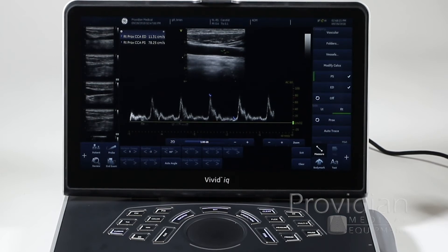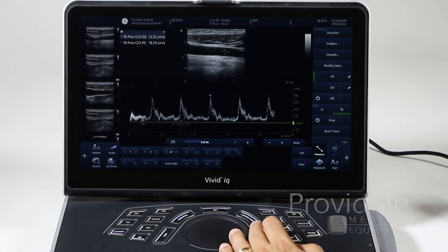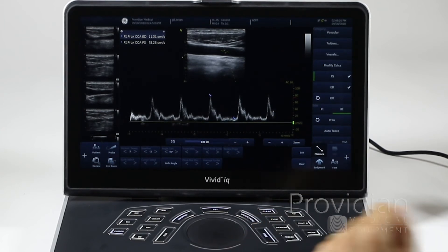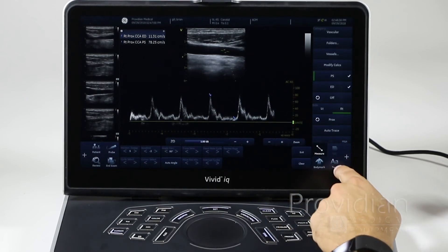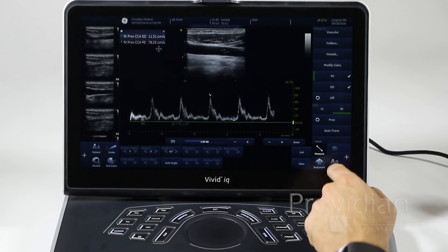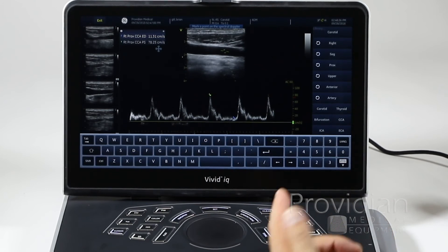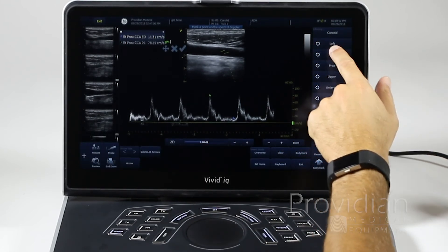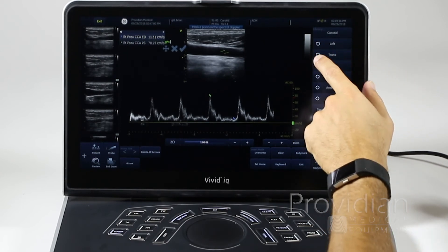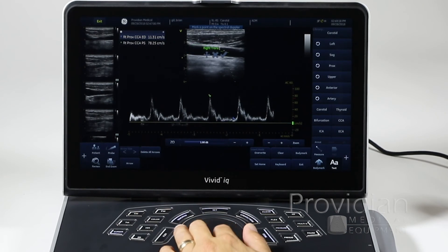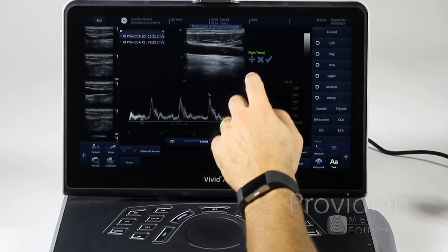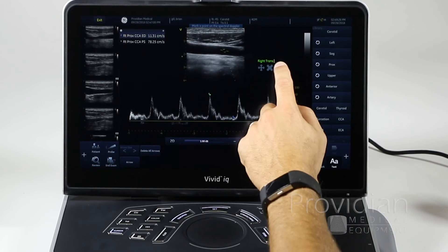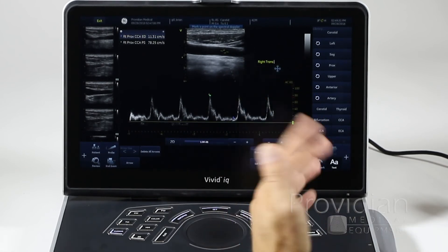For annotations, there's quite a library because tapping on a touch screen keyboard isn't a whole lot of fun. So if we want to annotate this, you just hit these A's here and can start typing in. It has automatic libraries — if I click here, each time I tap it can change because there are multiple things underneath. You can see the text over here, click and drag it around, delete it with the X or check mark. When it's yellow, that means it'll save. You can hit store and save that.